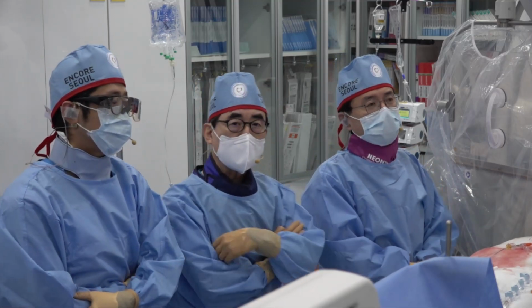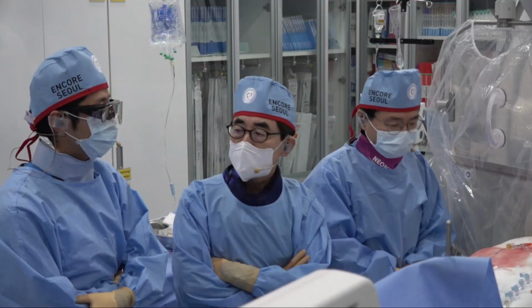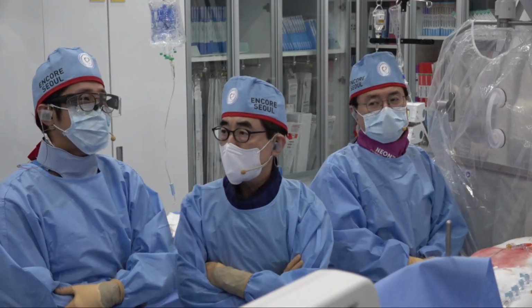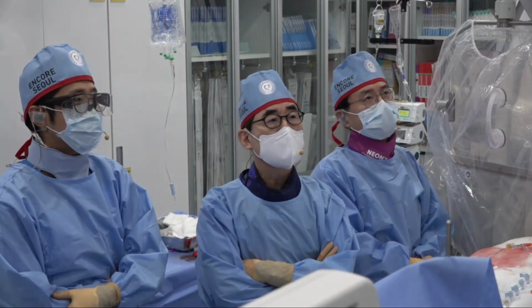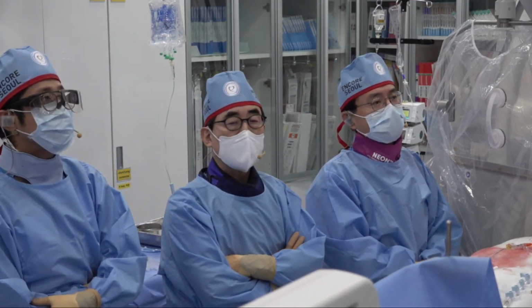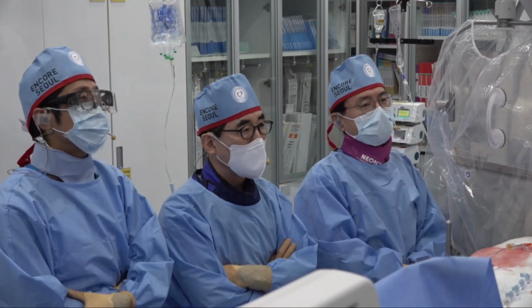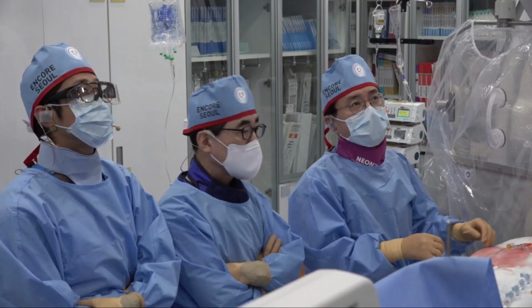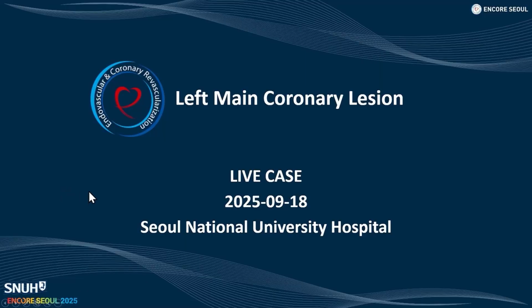First operator is Dr. Han Mo-yang and assistant Dr. Do-yeon Hwang and Young-gu Lee and many other staffs. Let us introduce our left main bifurcation patients. Dr. Yang, please. Okay, next slide, please.